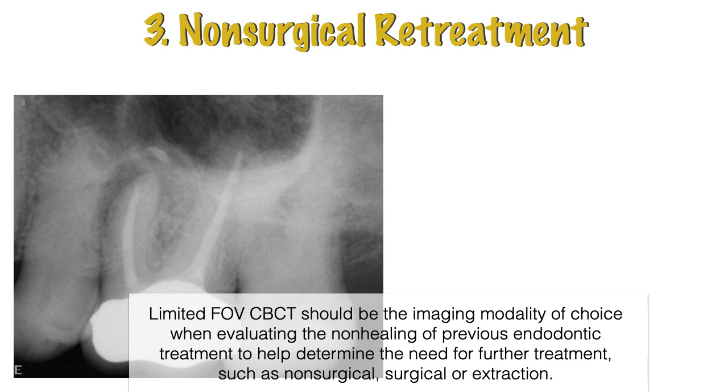What they're saying here is when we are looking at a tooth that already had endodontic treatment and we are assessing what's going on, CBCT is the imaging of choice. We still have to take a periapical radiograph to identify things and then determine that a CBCT is needed. But for these cases, most of the time, they are actually recommending that a CBCT be taken.